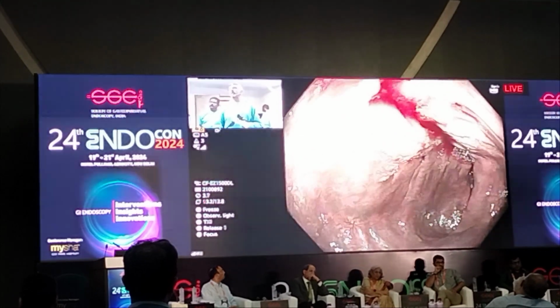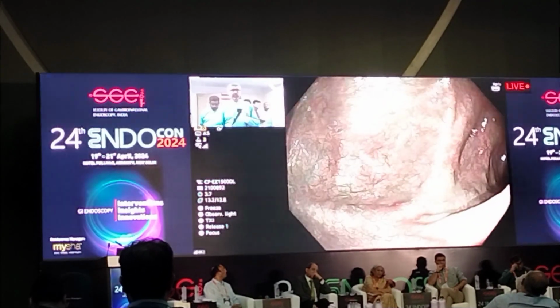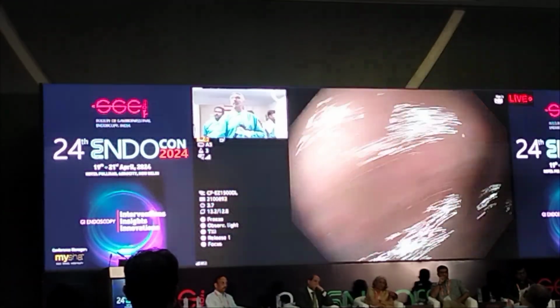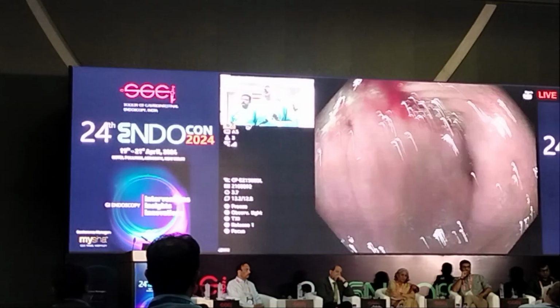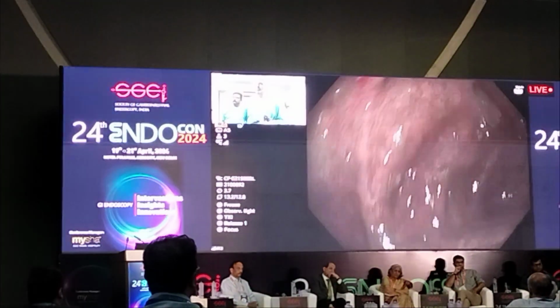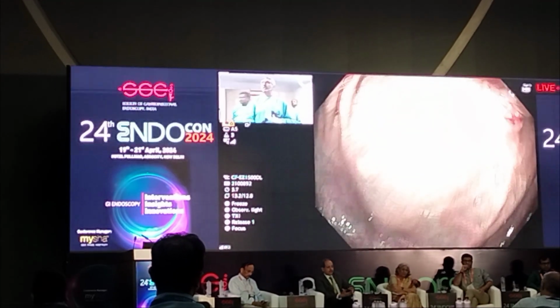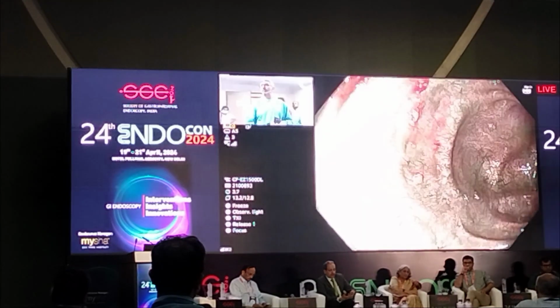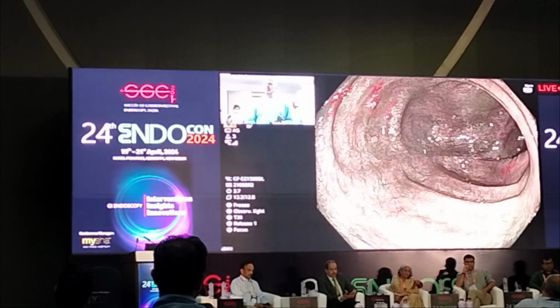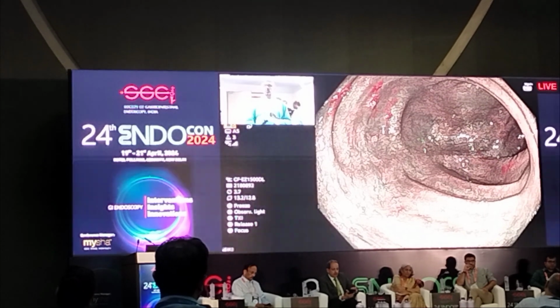So I've already withdrawn using a combination of both the white light endoscopy and the narrowband imaging, and I think that's important to do both because you can see different changes with the different imaging modalities. So I think it's very important to do withdrawal in each segment using white light, high definition, and then using narrowband to again withdraw from that segment. So we can come here and we can see very nice normal appearing mucosa, normal vascular pattern, no evidence of any active disease in this area, which would be consistent with his history.